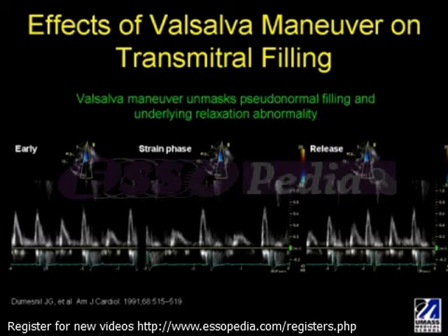However, I will say this technique is difficult to perform for both the sonographer and the patient, as the images may be lost or the sample volume moves away from the mitral leaflet tips. The idea would be to practice, so have the patient begin to bear down, reposition the sample volume to see what the image looks like, and then activate pulse wave Doppler.